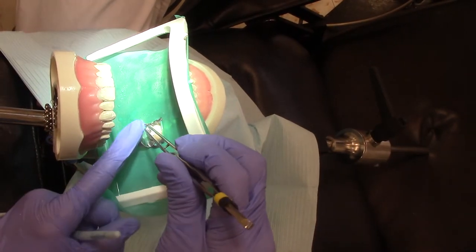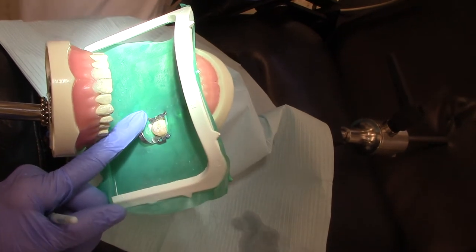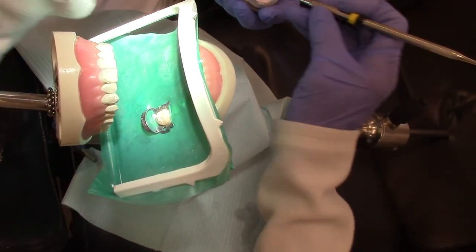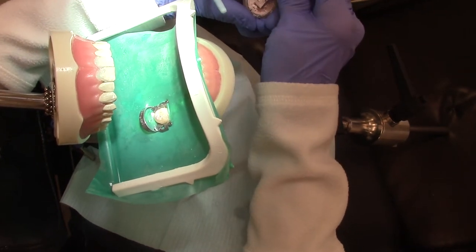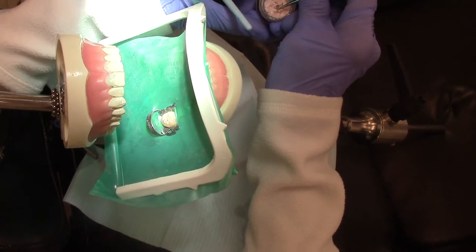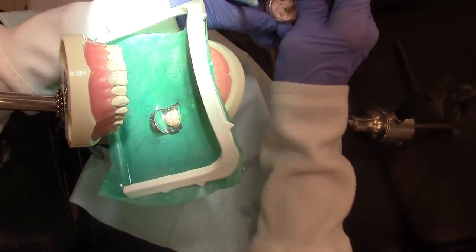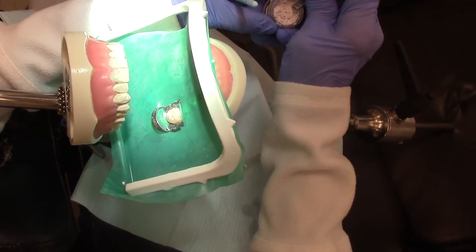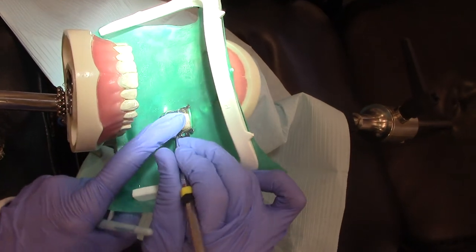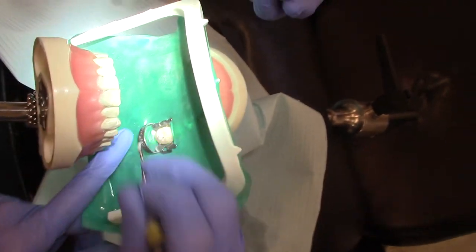Our next step is to put in a cotton pellet. We would put our cotton pellet inside of the tooth, and then we will put in cavit, composite, or amalgam — it just depends on what the doctor uses. This cavit is dried out and doesn't want to come out of the tube, but we would take our cavit, composite, or amalgam and pack it down inside of the tooth.